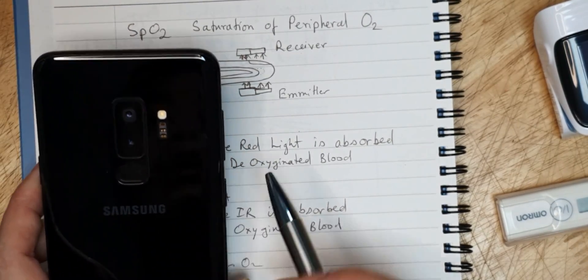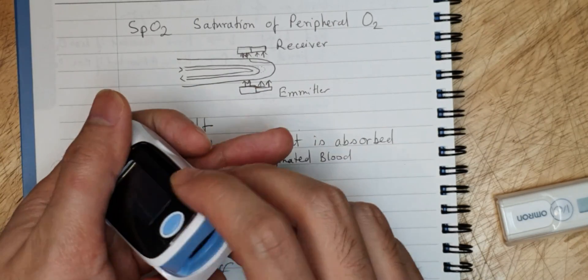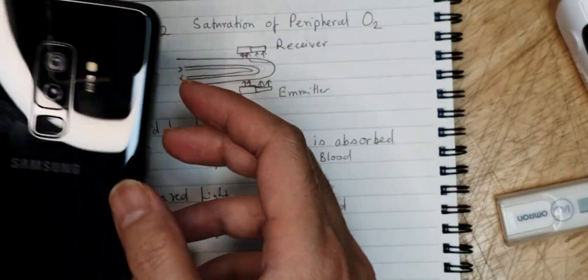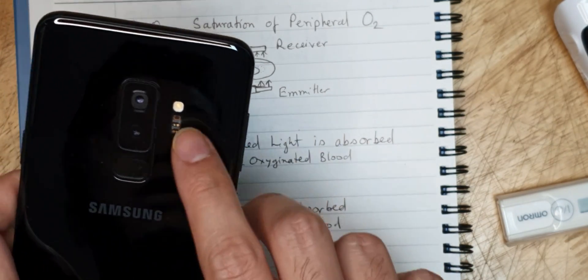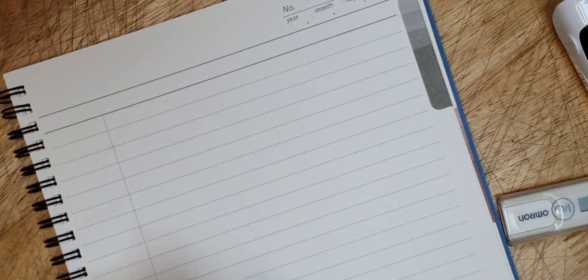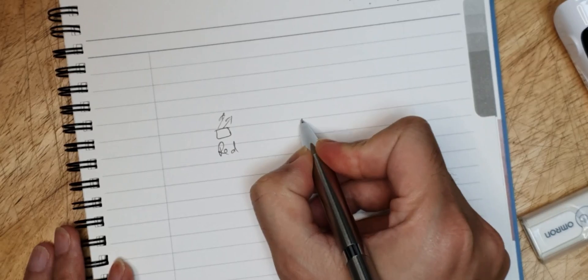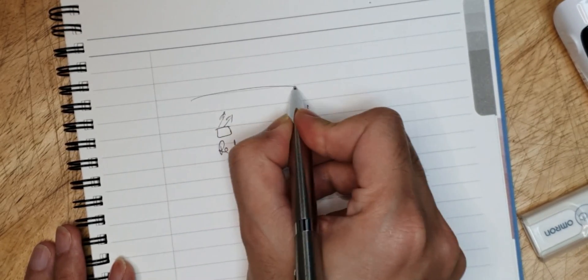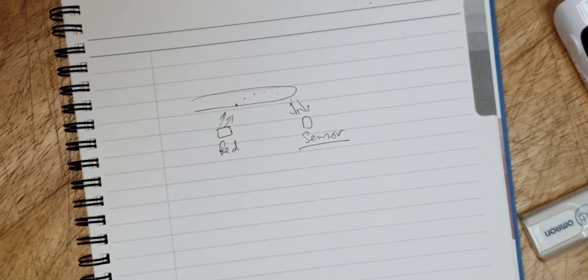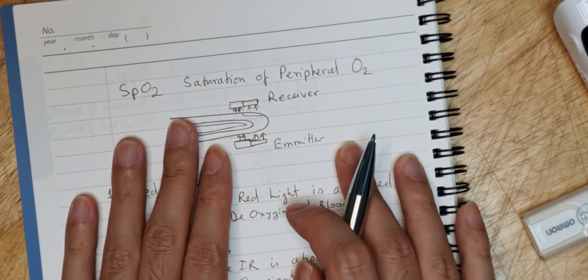These mobile devices have only a red light emitter and a sensor on the same side of the device. In contrast, a dedicated oximeter has the emitter on one side and the sensor on the other — you put your finger in between. Mobile devices can't do this, so the sensor and emitter are on the same side, relying on reflected light. This reflective arrangement is a less accurate way to measure SpO2.